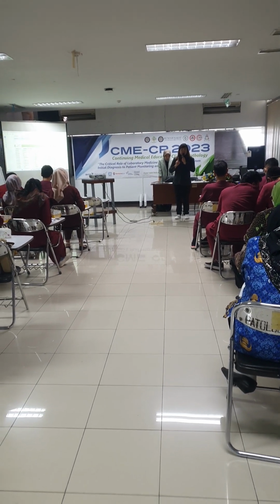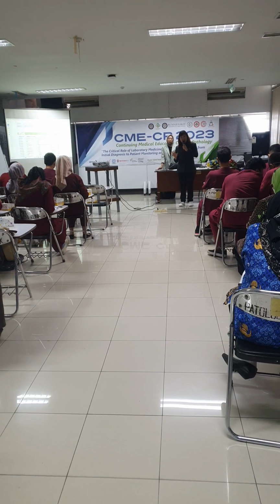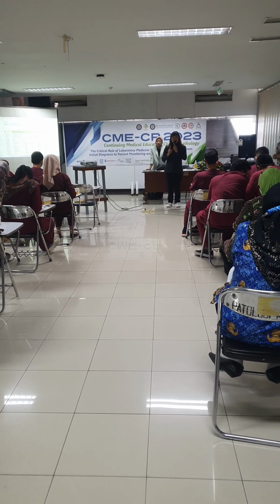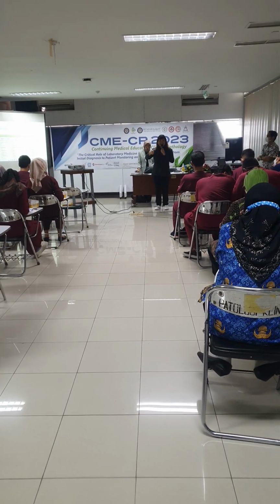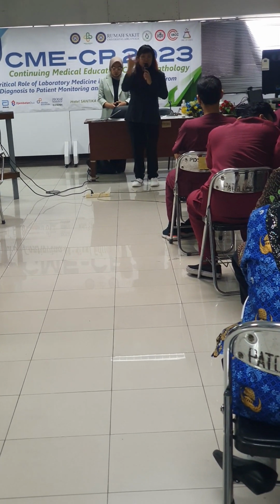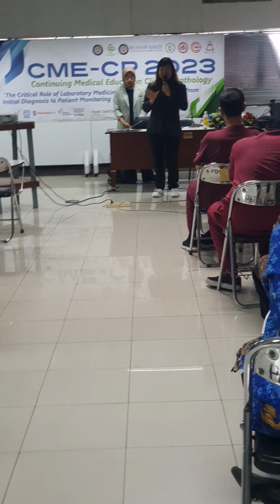What happens is even if you have 48 samples, 30 samples, 56 samples, although it's one time use, right, the cost itself is not divided by 96. Why? Because the cost is in the kit itself. Why we can make it open system and closed system. Closed system is because it's a kit.